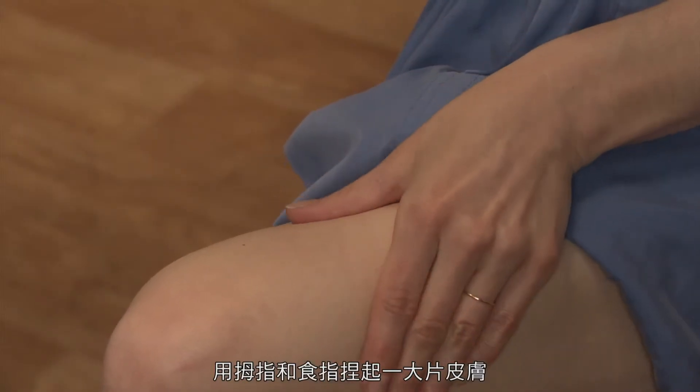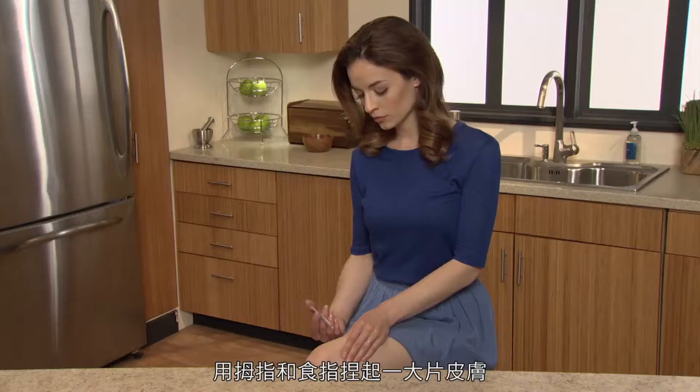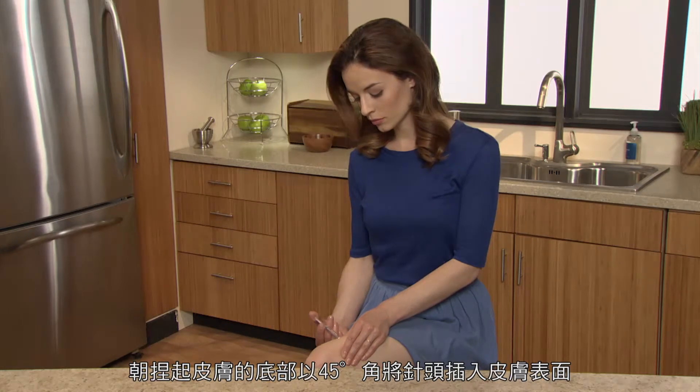Pinch a large area of skin between your thumb and index finger. Insert the needle at the base of the pinched-up skin at an angle of 45 degrees to the skin surface. Vary the injection site with each injection.